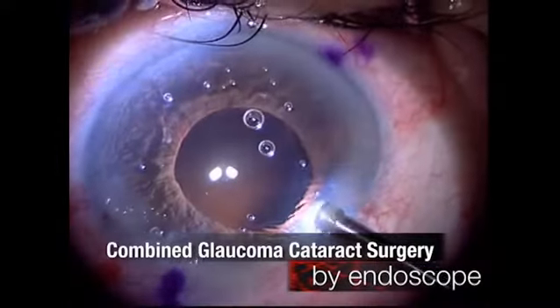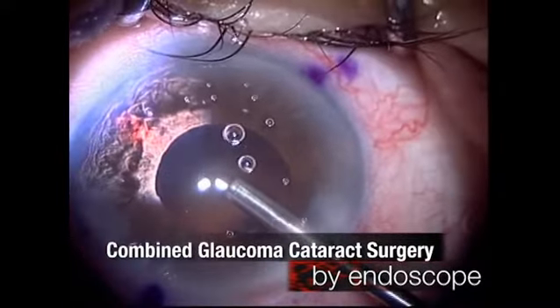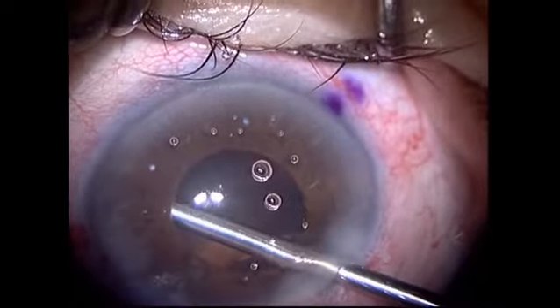endoscopically. Combined surgery for cataract and glaucoma offers excellent opportunities for the use of endoscopy. The transparency of the capsular bag can be used to obtain access to ciliary processes. These can then be treated by laser, preserving the conjunctiva without requiring suturing and presenting very low indices of complications.